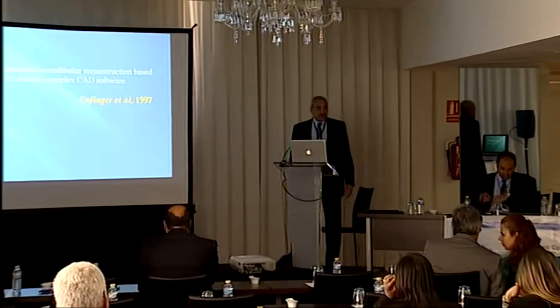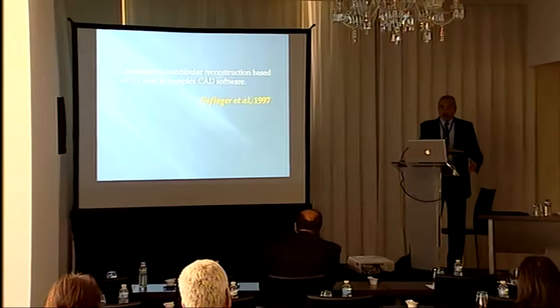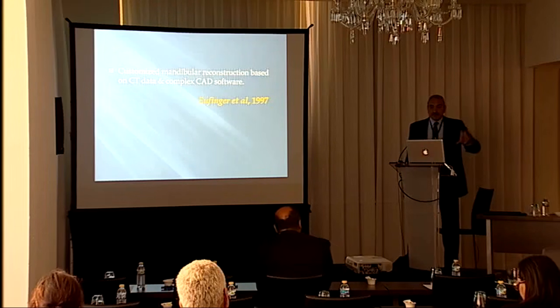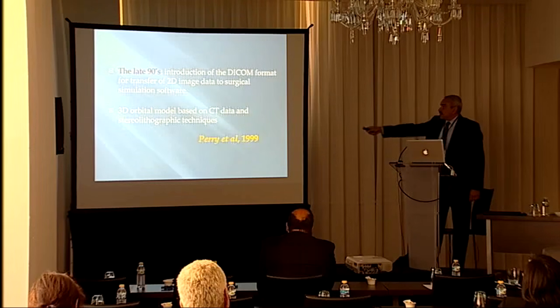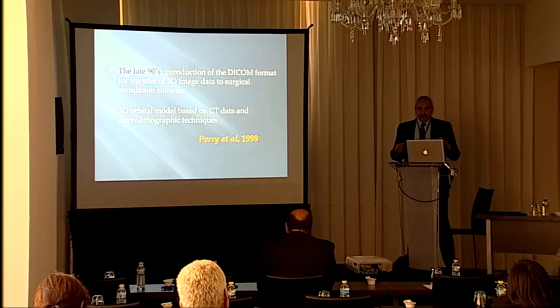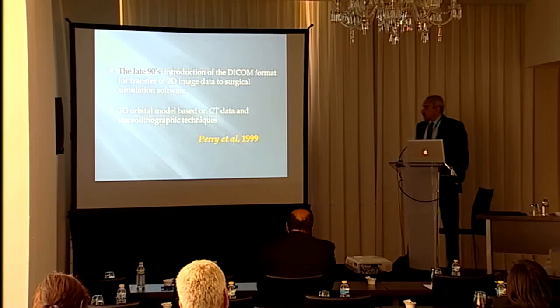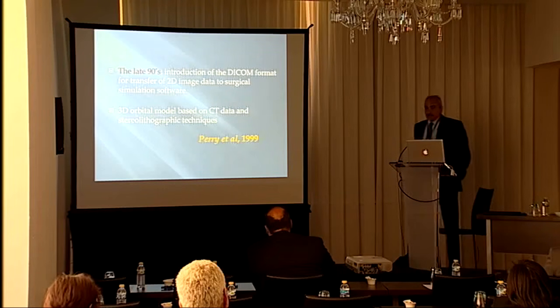mandibular reconstruction. He was using the CT scan images in 2D and putting one picture over the other in a manual form to represent and make the 3D model. But in the late 90s, with the introduction of DICOM file formats that allow the computers to import the DICOM files and make the 3D model electronically with simulation software, things started to go into action.